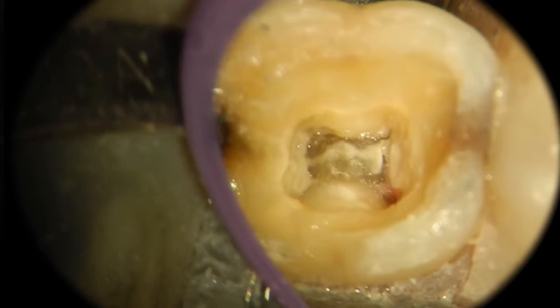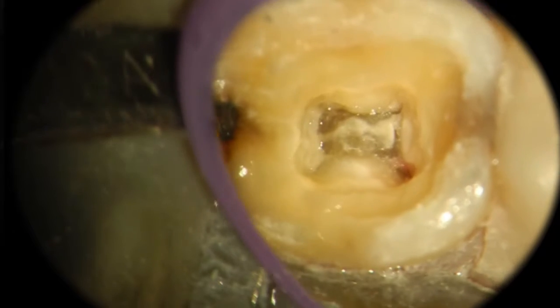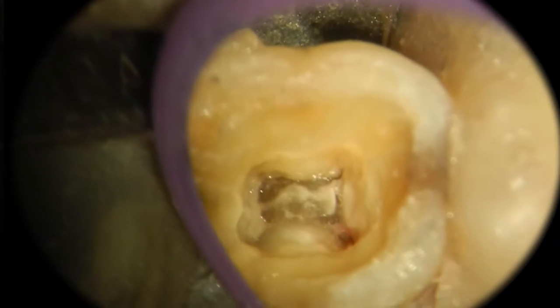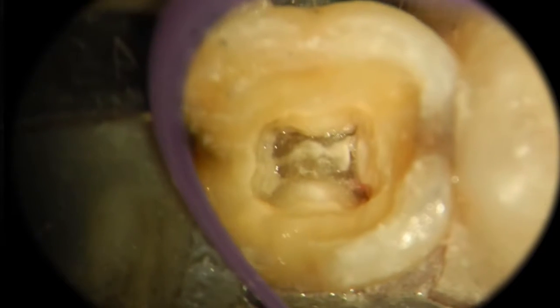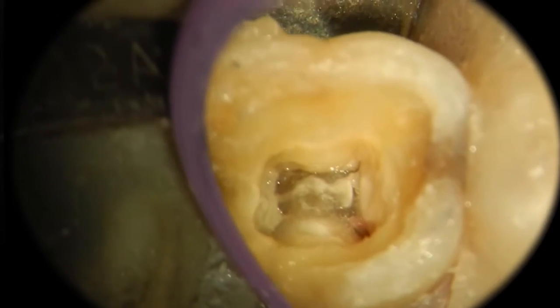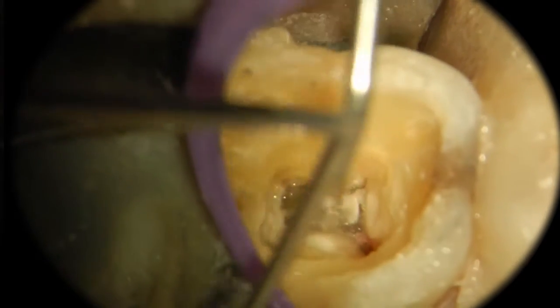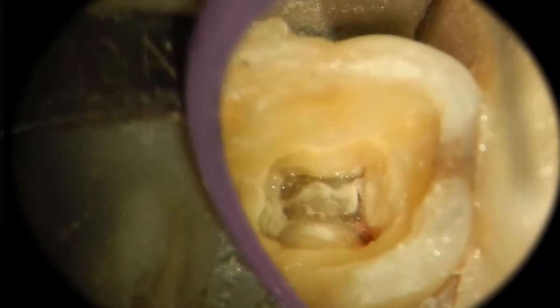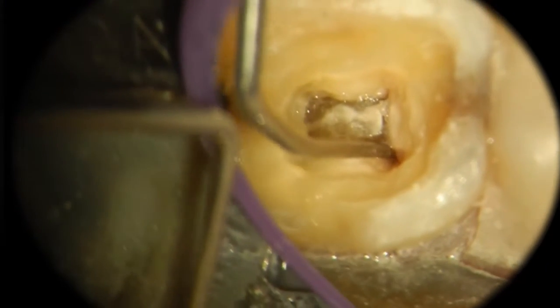But anyways, so now we're up to 0.66, and the second thing that I want to show you here is that one of the obvious tricks in finding orifices is a bleeding point. And you can see a bleeding point quite nicely here. And again, I'm trying to focus and look all at the same time, but there's our bleeding point.